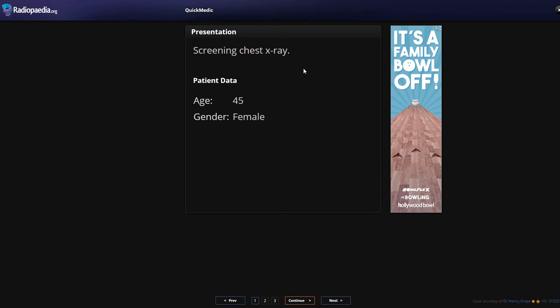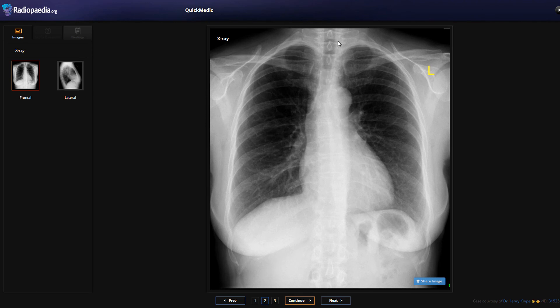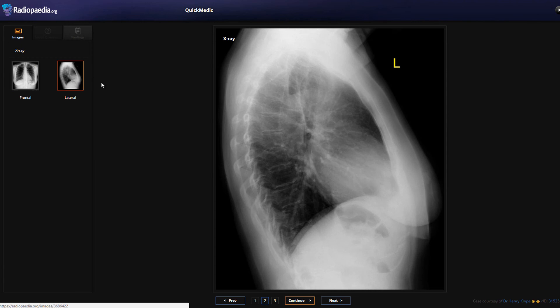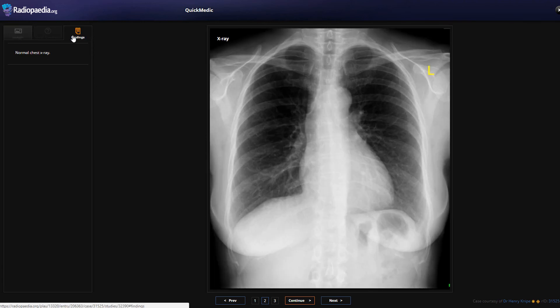This is a screening chest X-ray for a 45-year-old female. Using our ABCD approach: the airway - bronchus and trachea - looks in the midline. Looking at breathing and the lung borders, there doesn't appear to be any pneumothorax. The cardiac silhouette looks okay all the way around. Looking at rotation, the spinous processes look equidistant from the ends of the clavicles. There don't seem to be any focal processes and no evidence of rib fractures. The right hemidiaphragm is raised more than the left, which is normal. Overall this looks like a fairly normal X-ray - and indeed it is a normal chest X-ray.